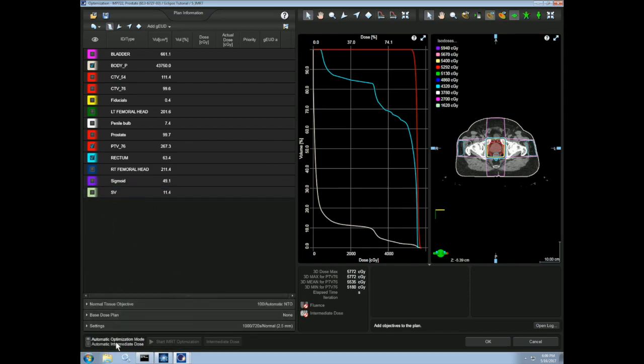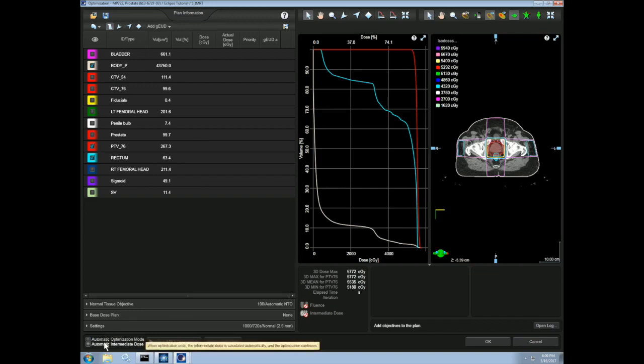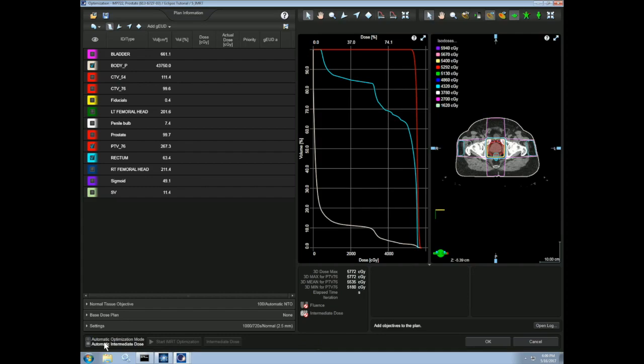We also have two checkboxes. The automatic optimization mode means that once the optimization is completed, this interface will close and the dose will automatically be calculated. Automatic intermediate dose means that the dose is calculated in the middle of the optimization process, which can give us a more accurate depiction of what an achievable dose distribution will look like mid-optimization.